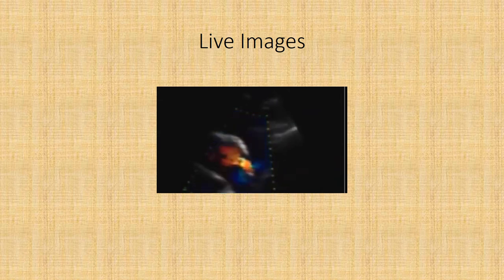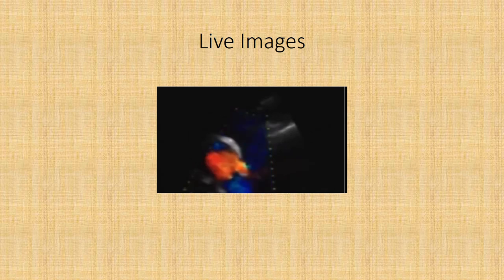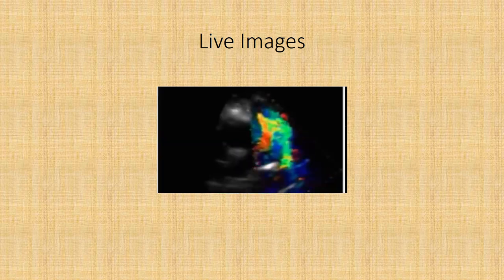Here's a shot at the aortic arch view level — you can see the PA, the arch coming down, and the blue flow showing the ductus right there. So all those views are very important to look at when you're looking for a ductus.